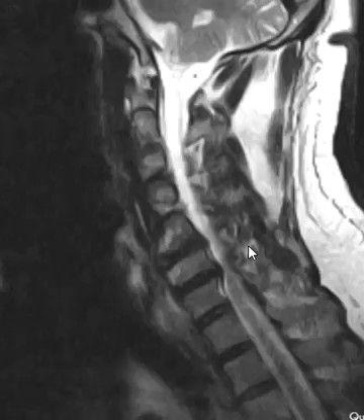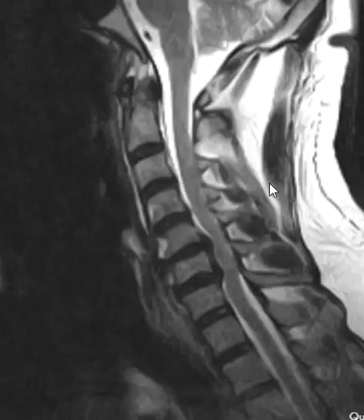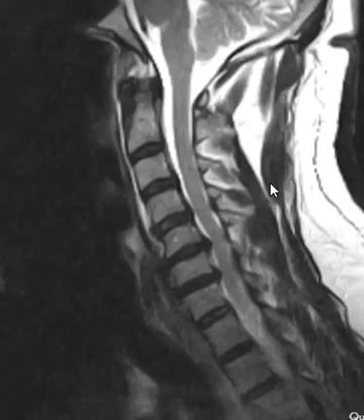And so some doctors, like this doctor who ordered this, knew that is often the case, and they ordered the cervical spine and the shoulder at the same time. This also goes with the lumbar spine. Lots of times people have pain in their hip or leg, and they want to know if they should have a hip MRI or a lumbar MRI, and some doctors just order them both because they know there could be findings in both. So after that long introduction, here we go.